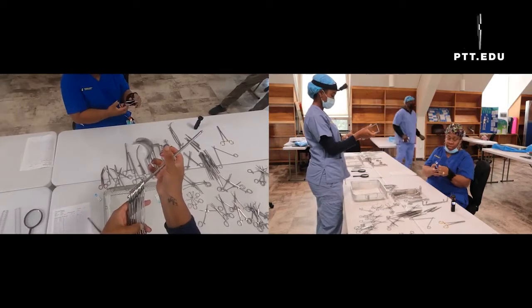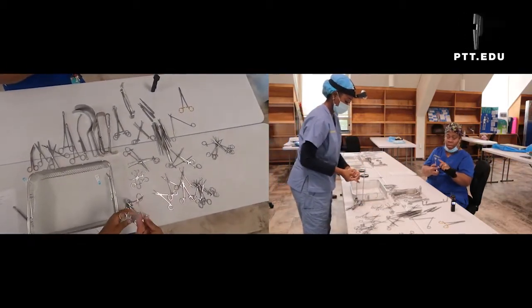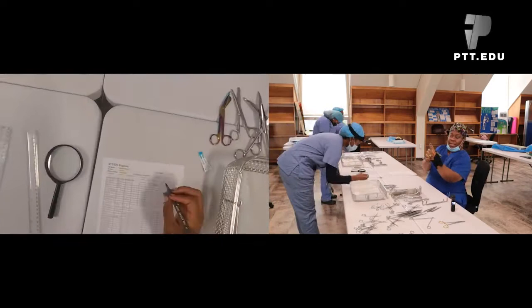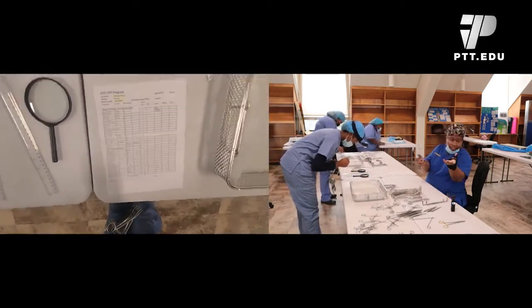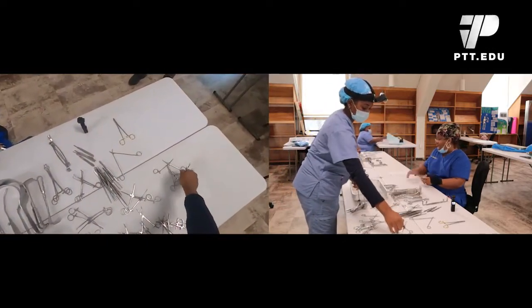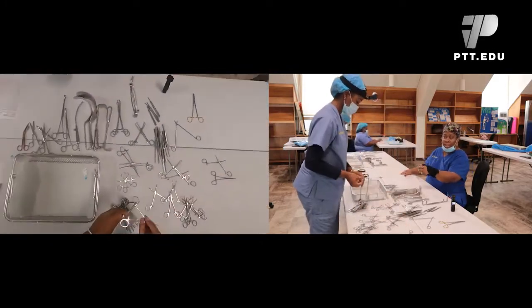So one of the wonderful things about a Weitlaner is they come in several different sizes. That's number one. Some come blunt as well as sharp, as well as blunt and sharp, meaning that this side here is blunt, or some people like to call it dull. There you have it. And then this one here will poke, sharp. So depending upon what's requested on the actual count sheet is what we will actually give them.